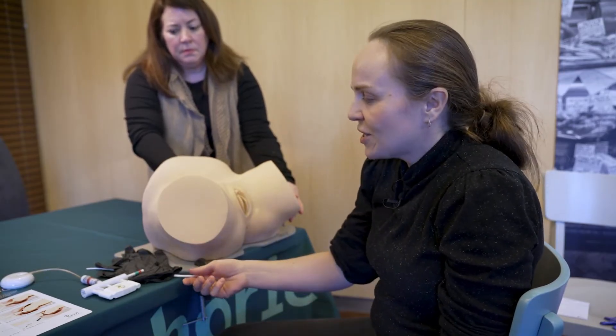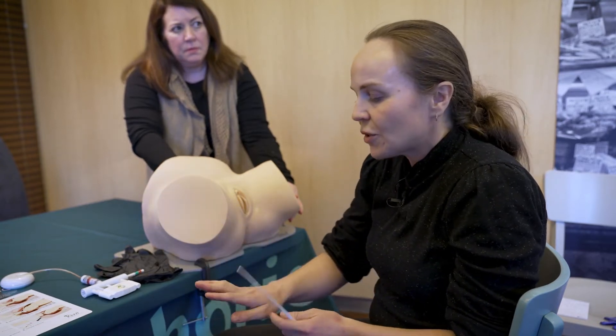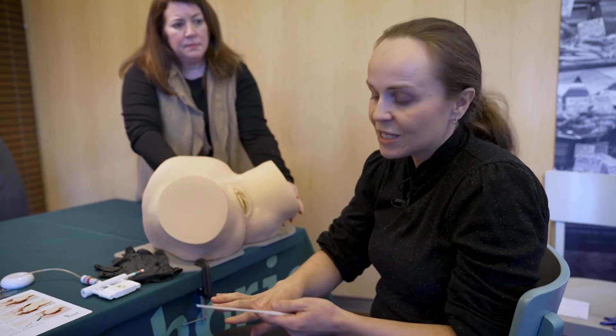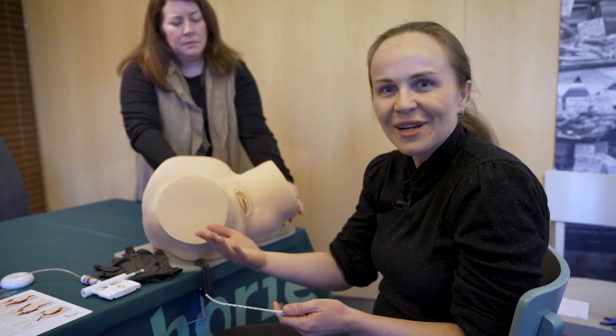Also assess the colour of the liquor — whether there's any meconium or blood. Before proceeding with vacuum delivery, you need to know how long the middle finger on your examining hand is, because you're going to use your longest finger as a ruler later in the process.